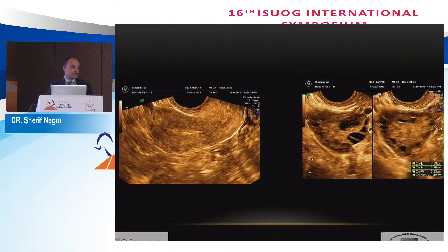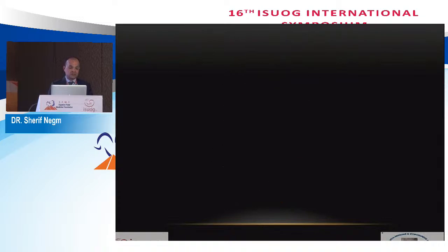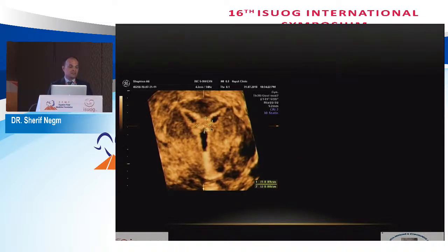Finally, I just want to show you this patient that came to me complaining of hypomenorrhea. She had polycystic ovarian infertility, and her doctor previously diagnosed her as having a small septum, and he did a resection for her, and the operation ended in a disaster with dense intrauterine synechiae. You can see this part here. This is saline that we injected in order to help delineate the cavity. You can see this part here, which was completely destroyed because of the intrauterine adhesion.